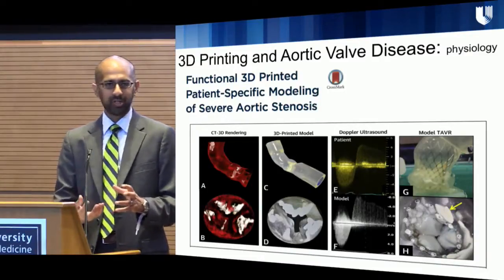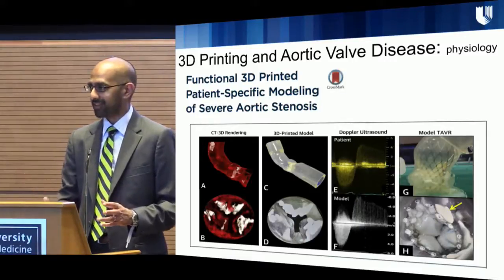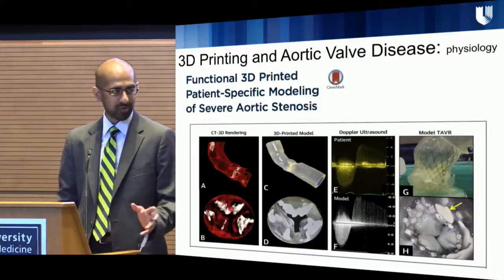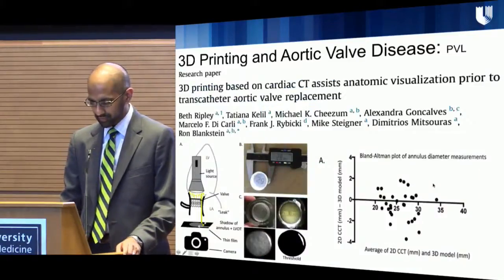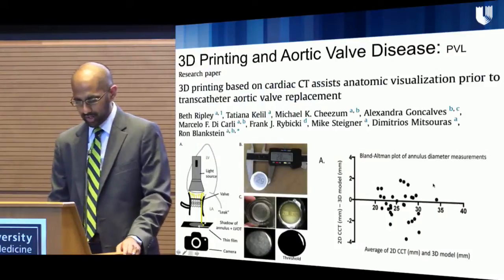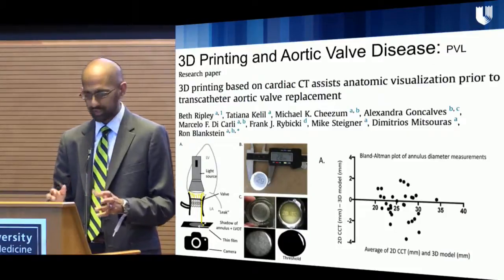You might say, what was the gradient? What was the fluid? They actually hooked this up to an LVAD to do this, one of the older LVADs that's not continuous flow. Okay, so how about actually using this in sort of clinical assessment?